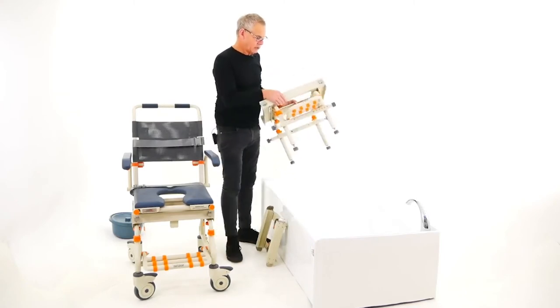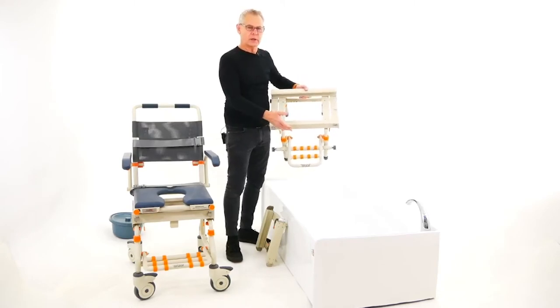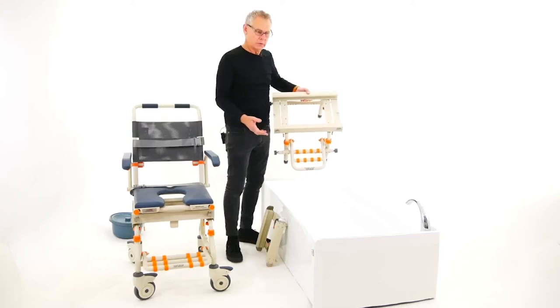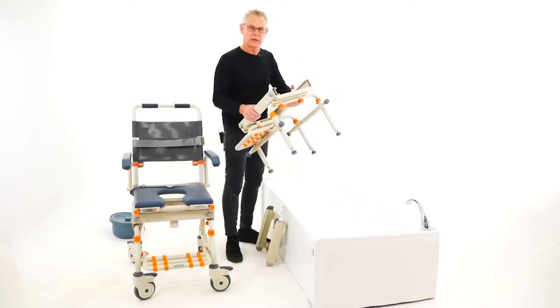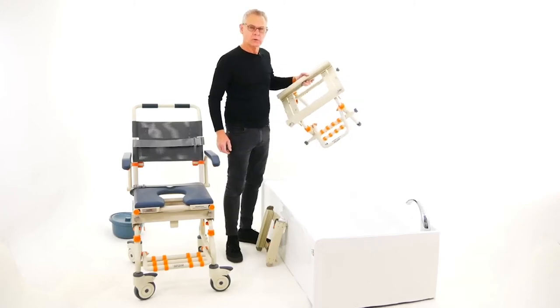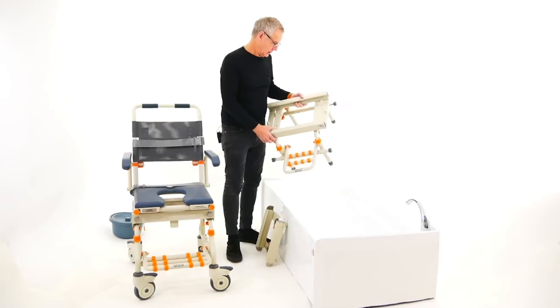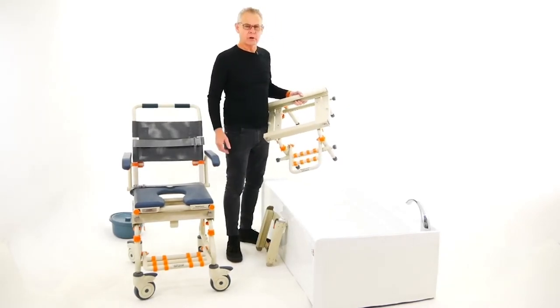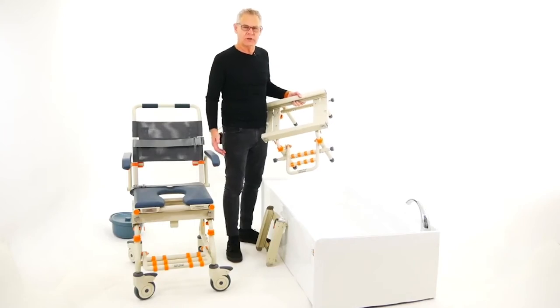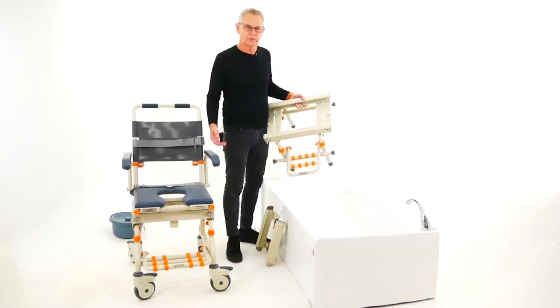The beauty of the Shower Buddy is that the bath base allows you to transition to shower over the bath. When you're not using it, the bath base can just go away in a cupboard or hang on a wall, and the bathroom is available for all other family members. This system also saves a lot of remodeling costs, stress, and hassle.